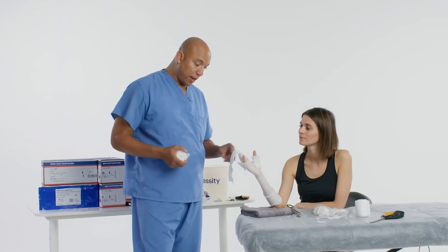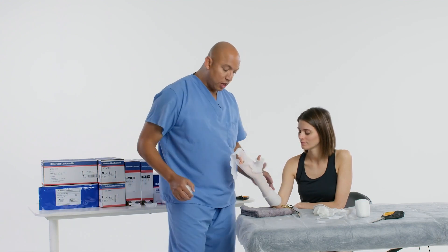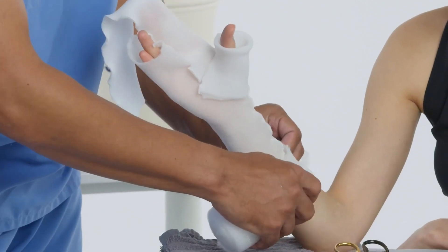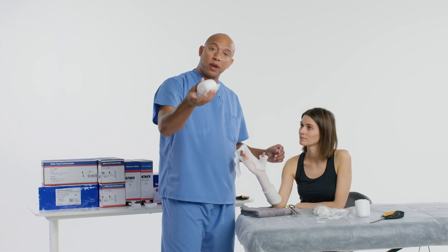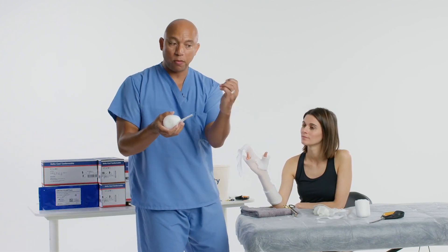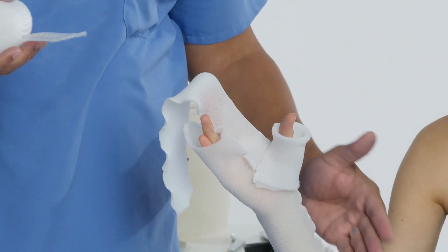Now it's time to apply some padding to the patient. I've got a little cuff there, which will be nice when it's time to envelope it in — I'll have a nice little padded edge. The padding has a little memory from being folded or rolled, so I can tuck that underneath the little cuff.